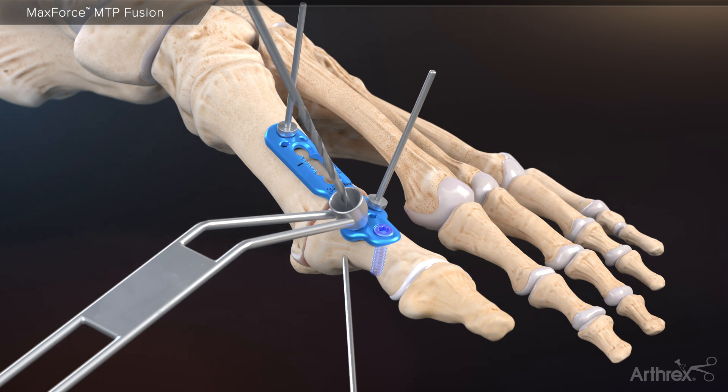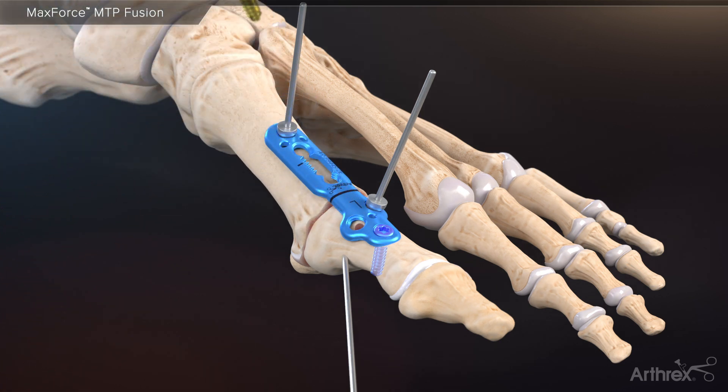Proceed to place two 3.0 millimeter variable angle locking screws into the proximal phalanx by using either the VAL drill guides or the traditional locking drill towers. The 3.0 millimeter VAL screws have a 30 degree cone of variability.